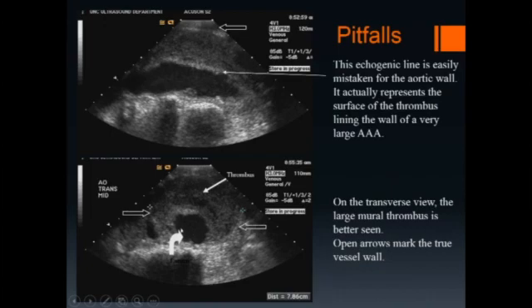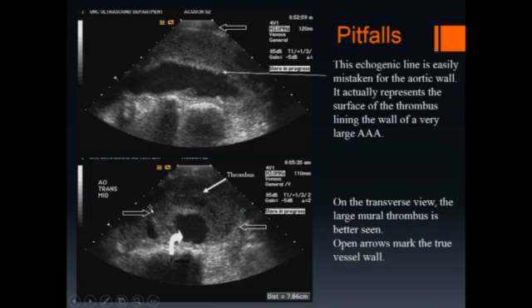On the transverse view, the crescentic-shaped thrombus is better seen. The true position of the aortic wall is marked by the open arrow on the longitudinal image and by the open arrows on the transverse image. The true diameter of the aneurysm is shown by the position of these calipers.